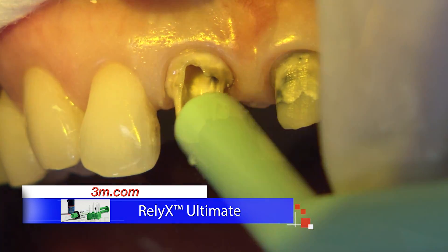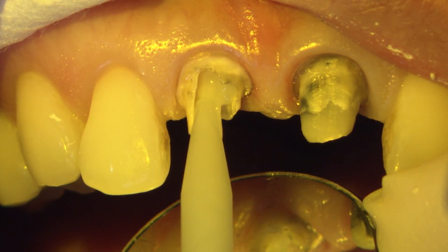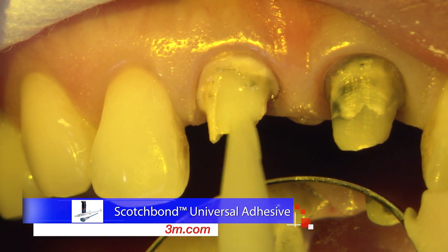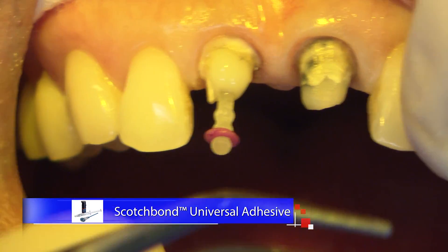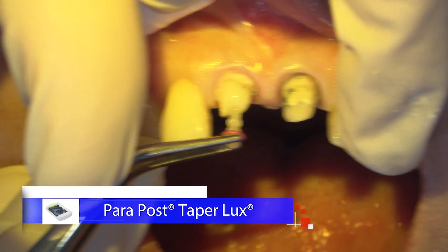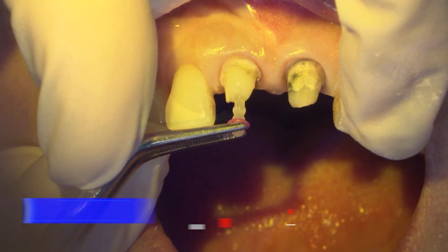After suctioning the excess and air thinning the adhesive, we light cure for 10 seconds. A thin layer of adhesive is also applied to the post and cured. Cement is applied to both the canal and the post and seated slowly to help minimize the risk of bubbles. The post I'm using is Coltene's Parapost Taper Luxe — the tapered nature fits really well into the canal space with good retentive features. Once it's seated, I'm applying apical pressure while we fully cure the top for 20 seconds. Whatever cement you use, make sure it's a self or dual cure so that the deeper area is set properly.